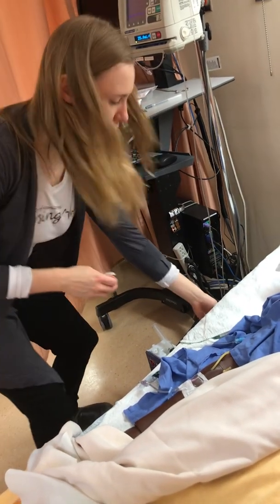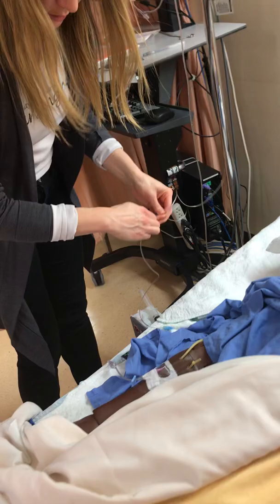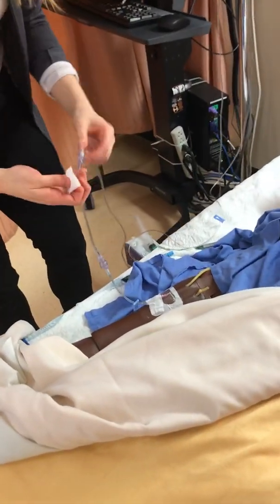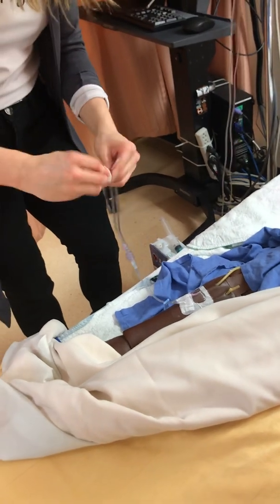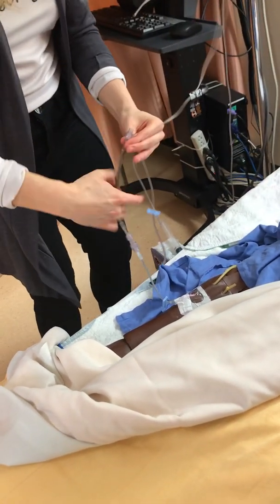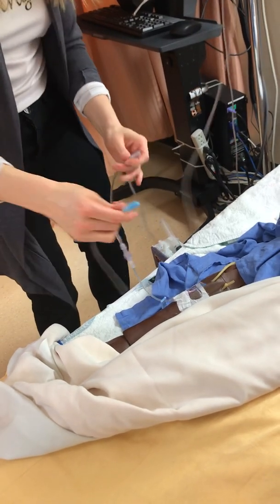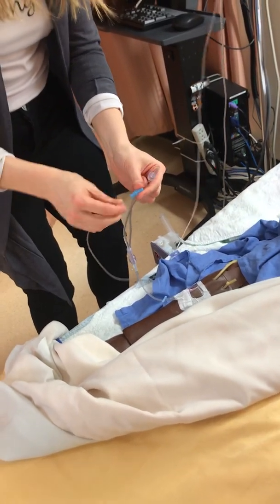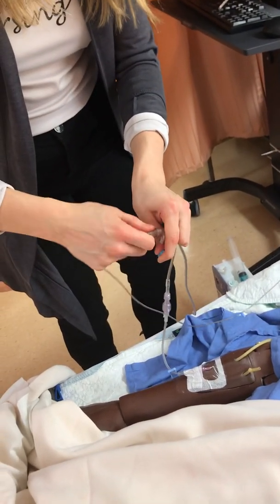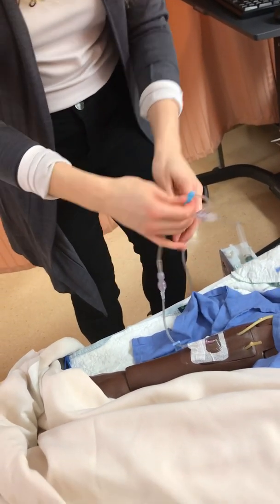and I'm also going to clamp this while we wait. So I've already checked the patency of the IV. I will grab the port, swab it for 30 seconds, let it dry for 15 seconds, and while maintaining sterility, attach this line to the port. Everything has remained sterile.